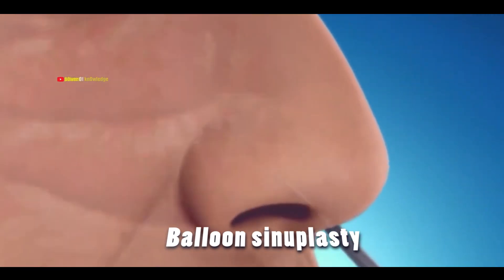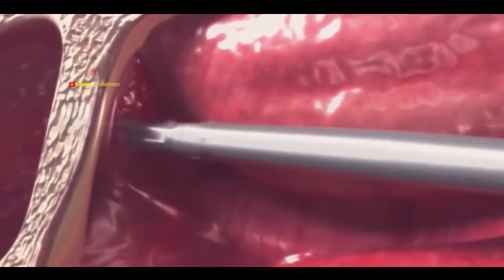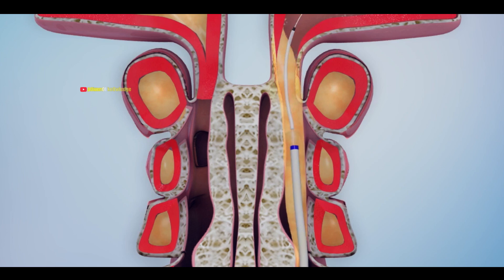Balloon sinuplasty is a medical procedure where hollow spaces in your skull are opened using a balloon. This helps drain mucus trapped in your sinuses.